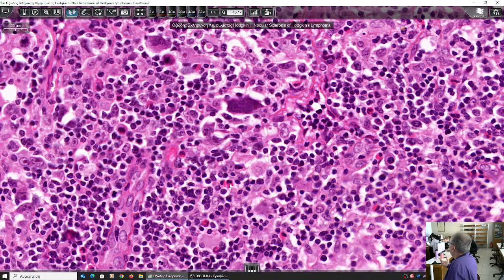Now your knowledge is deep enough because you understood what you saw, not just what the multiple choice question from the test said. Anyway, what are these cells?